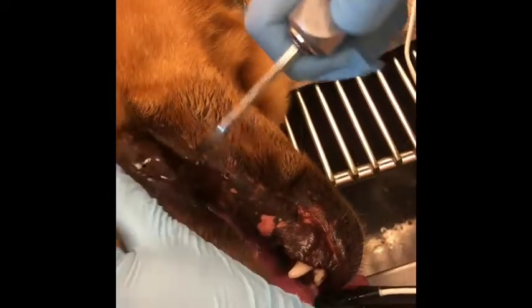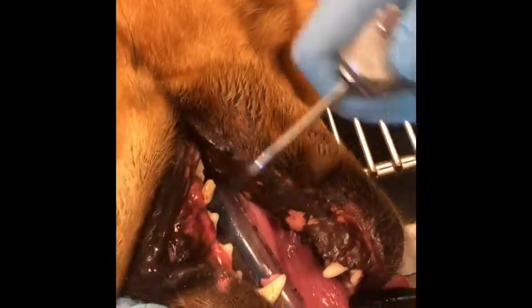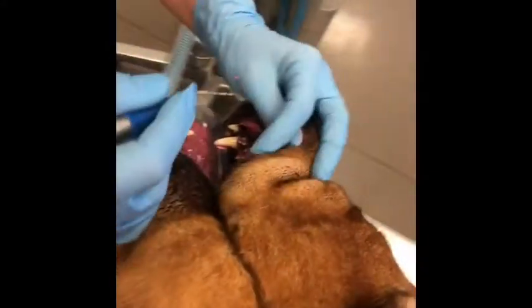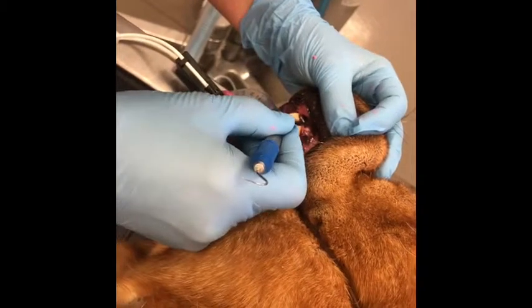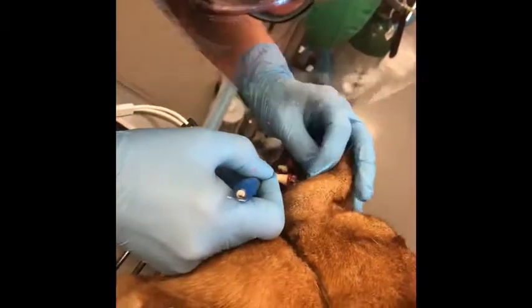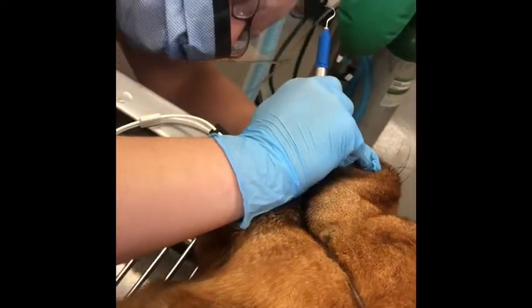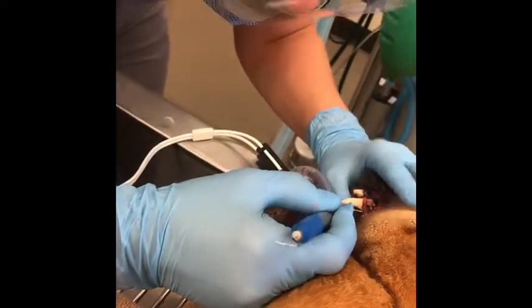We also want to clean out the tooth that we're fixing to start working with. Now that we're completely finished, we're going to probe one last time. Anytime we do that, we want to do it in at least four different spots and check our millimeters to make sure nothing is above four millimeters. All right, that's it.